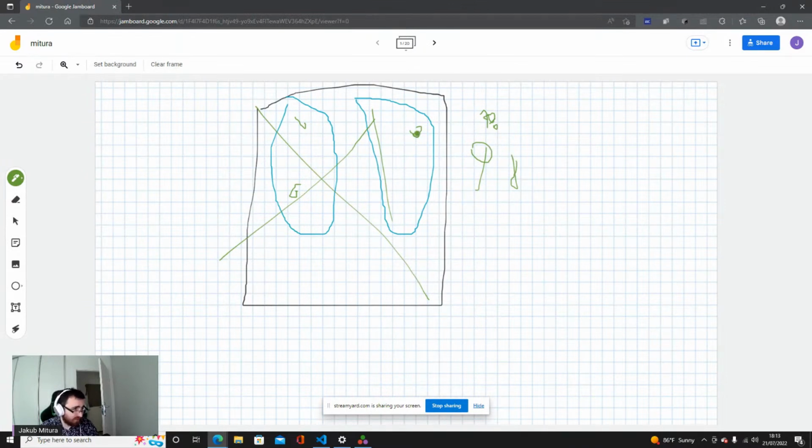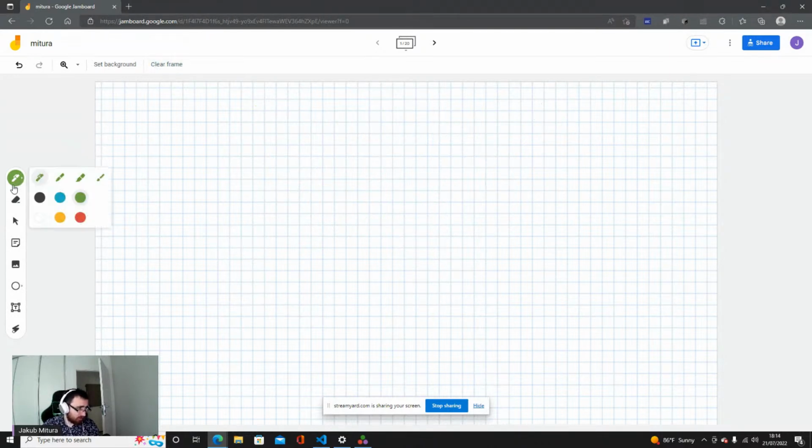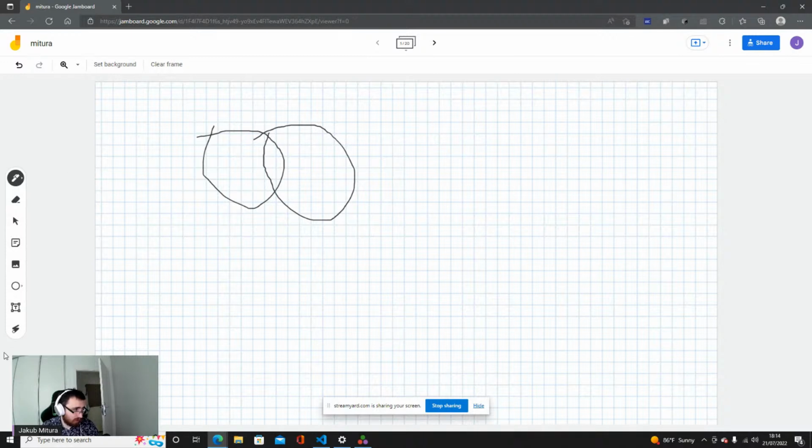That's why we need to take into account this misrepresentation of different labels. And one of the ways to do this is the dice metric. This is a very classical, still very useful metric. However, when you think about what the dice metric does, it basically takes into account how many voxels are really recognized in the structures compared to how many are not recognized.